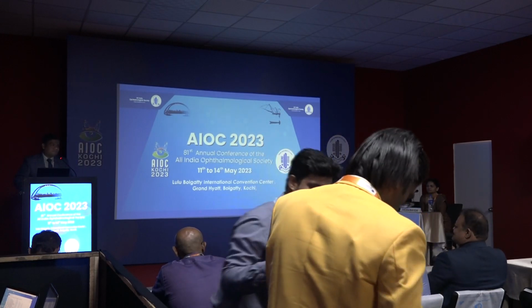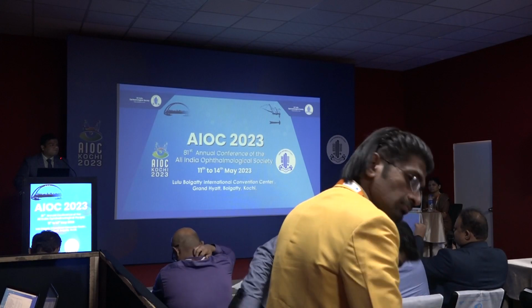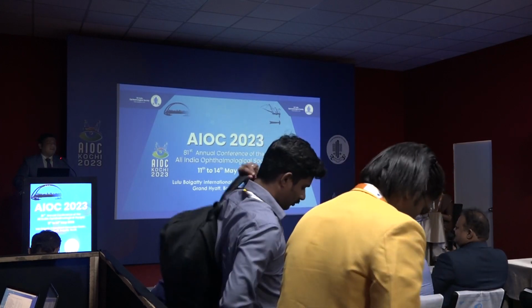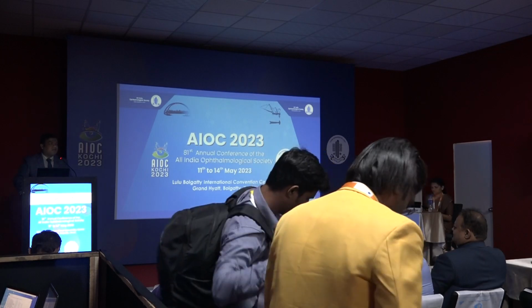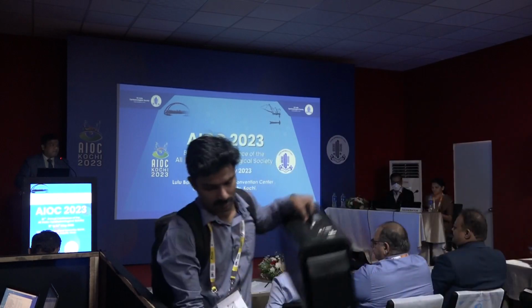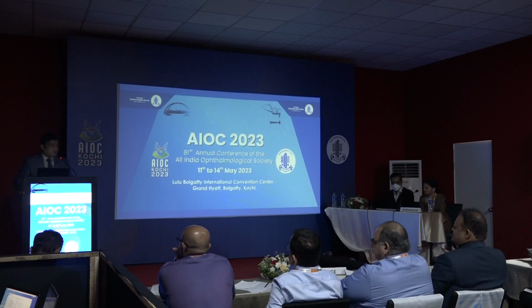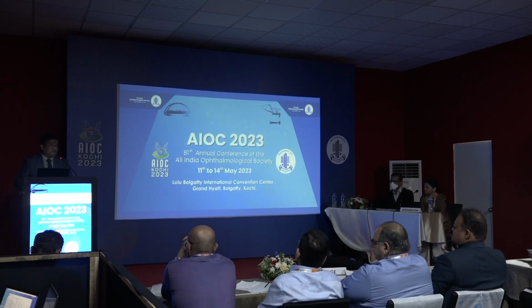Obviously, yes, the field needs to be enlarged more. When you are using the spectacles, does it reduce the signal strength? Yes, slightly reducing the signal strength, sir. But if the cornea and the lens are relatively clear, then we are getting good images. But yes, if the lens is cloudy, then the signal strength is slightly reduced.